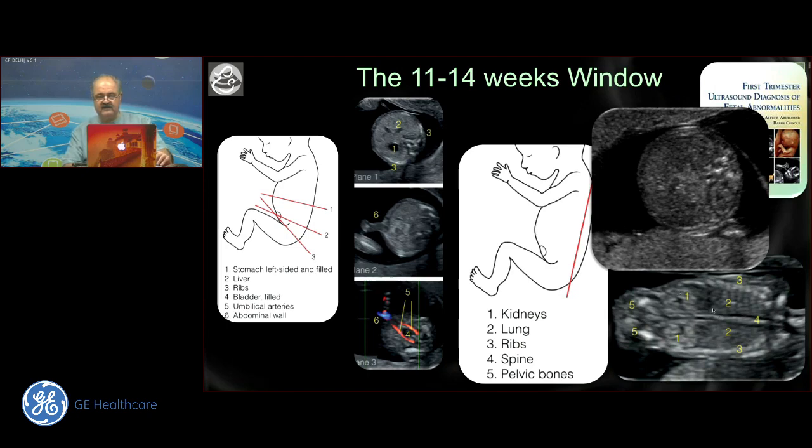Very often, the kidneys might stand out much more in a posterior coronal section of the fetus, in which you might see most of the ribs, you might see part of the spine, and then you see these 2 echogenic areas at the back, and they appear fairly bulky, and those are the kidneys in fact. But invariably when you see these, remember you're on the right plane if you're seeing the iliac wings, and then you won't mistake these. But usually what happens is that the reniform shape stands out so well that you will know that this is a kidney, and you don't really require any clues beyond that.